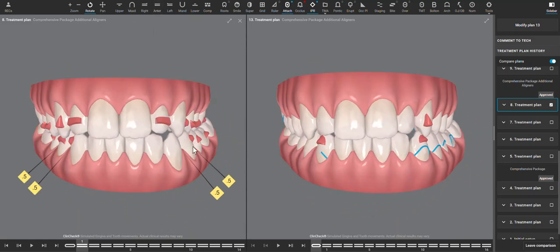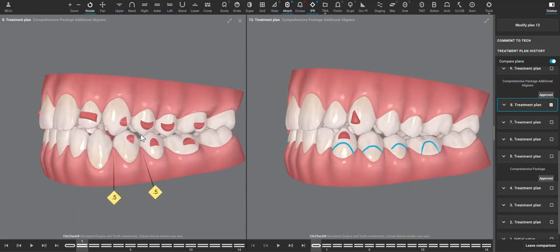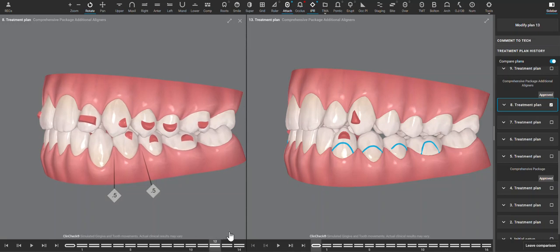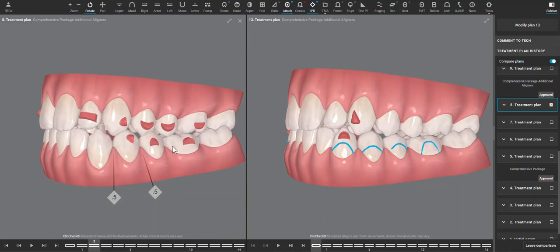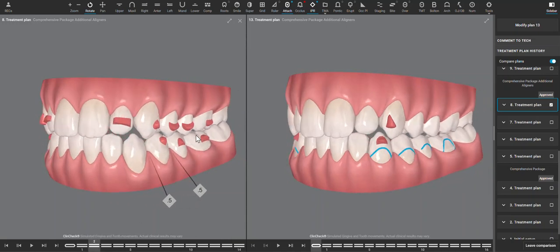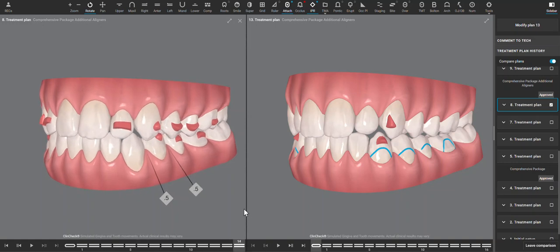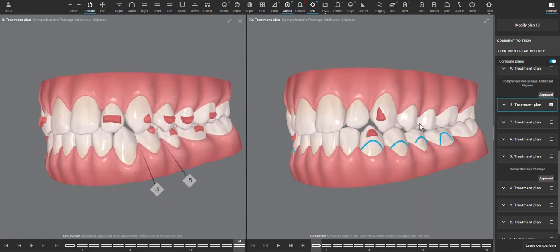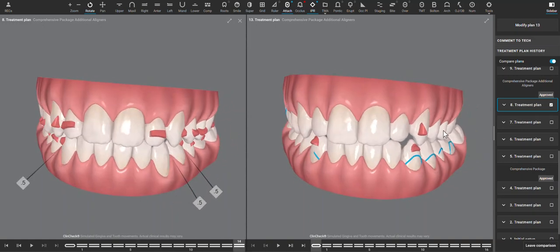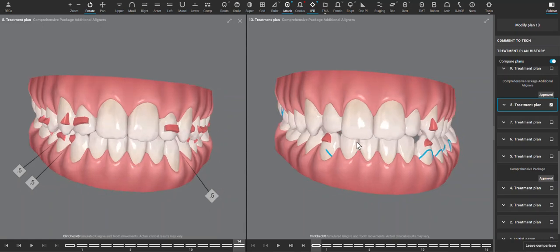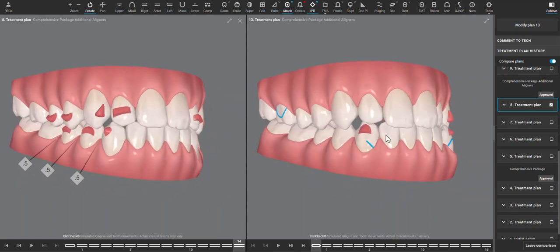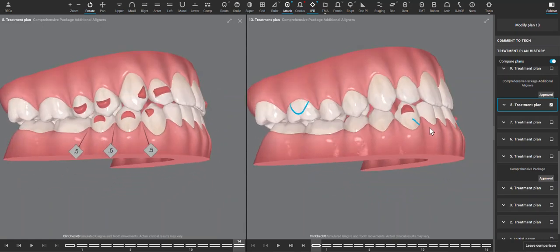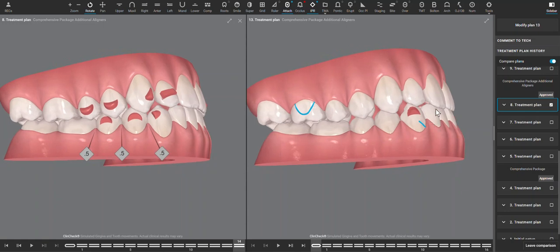And some of these premolar movements, I can understand them trying to correct the crossbite, but these lower molars tend to not move lingual. Fortunately, the upper premolars did, and so now we're looking at a crossbite that's nearly corrected—not quite, but improved—and still an anterior interference, which is the main cause of this posterior open bite.